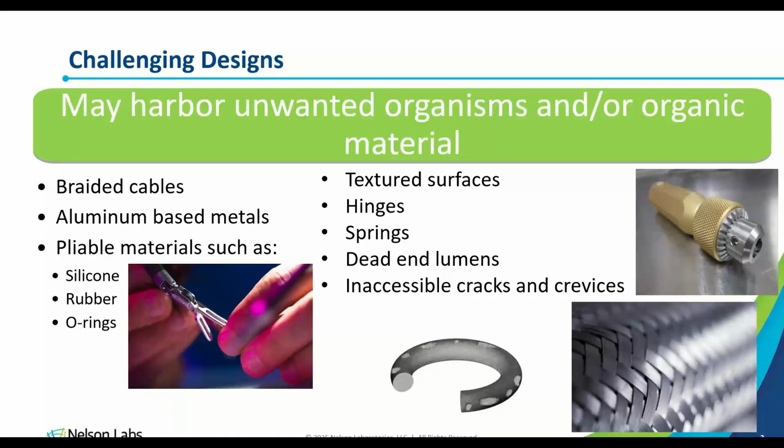Bacterial endotoxin measurements are required for medical devices, but it doesn't appear to be a requirement for medical instruments. Is bacterial endotoxin measurement on medical instruments required? If not, why not, given the risks associated with endotoxins?